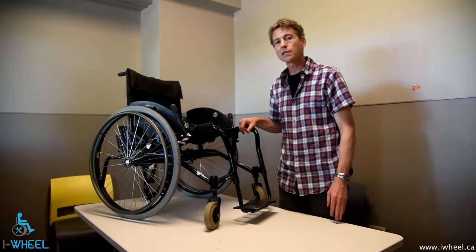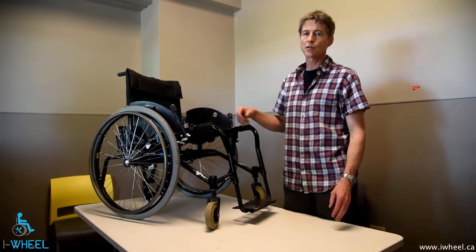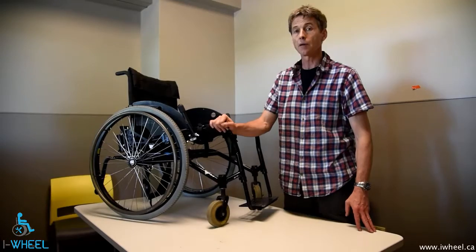My name's Ian Dennison. I'm an Equipment Specialist at GF Strong Rehab Centre and I'm here to talk to you about cleaning a wheelchair.